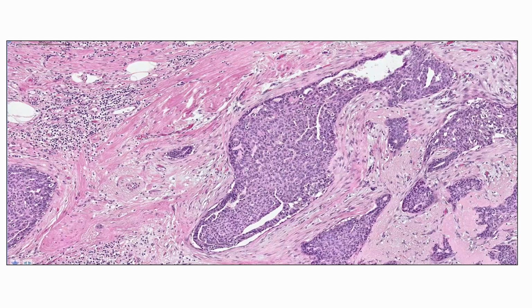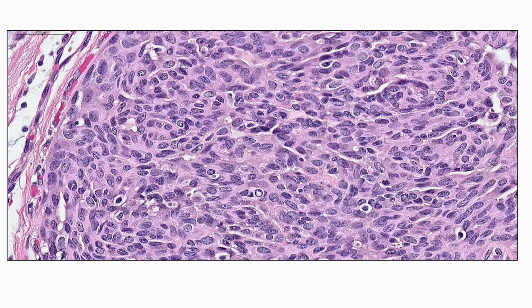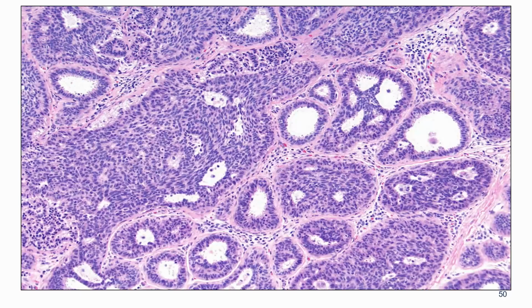So here is a lesion that could easily be interpreted as DCIS or even invasive carcinoma. You've got very distorted nests of epithelial cells, this funny-looking cellular fibrotic stroma. You've got to try and remember that there are benign sclerosing processes. If you look, you've got these slit-like spaces, and if you then examine the cells on higher power, you can see they're very heterogeneous looking. There are some intranuclear inclusions, maybe some nuclear grooves in places. And so this is usual ductal hyperplasia, not DCIS.